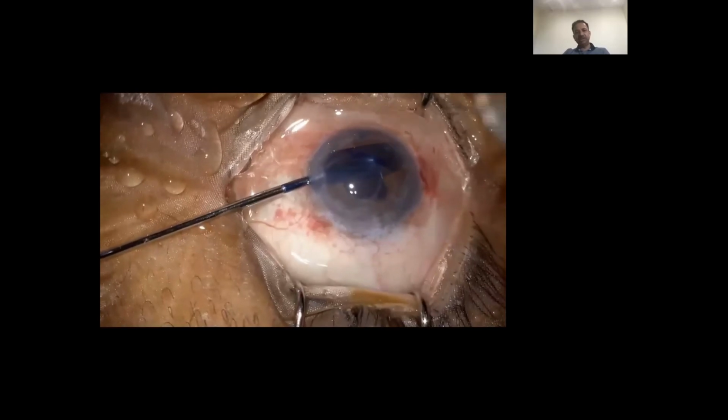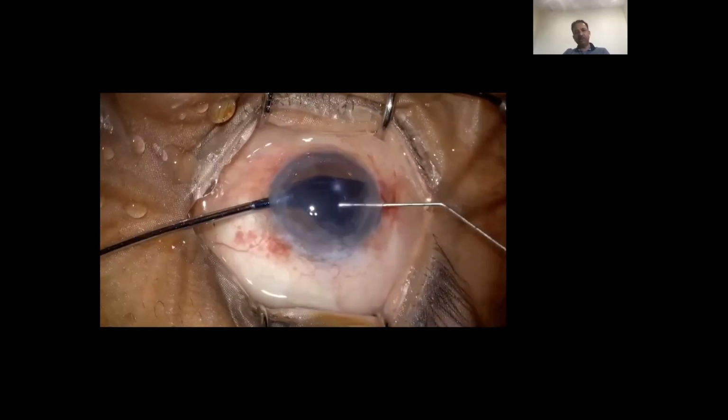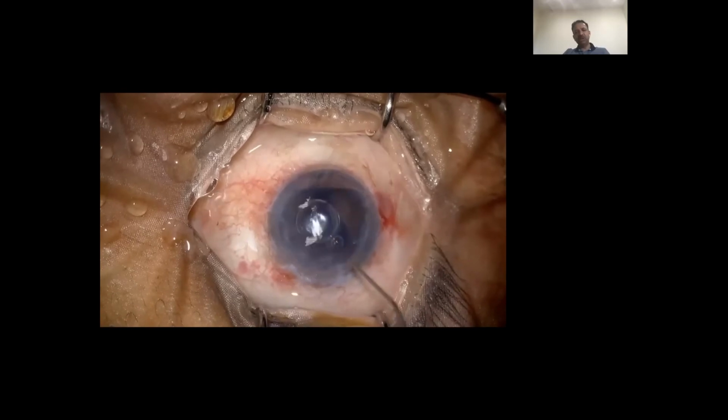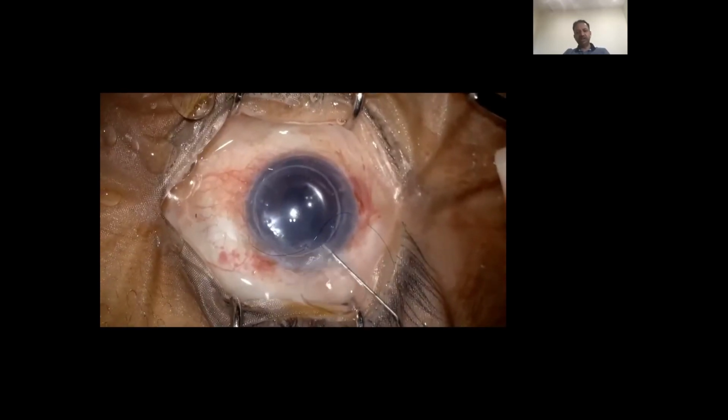The AC maintainer is running very slow. You keep holding the graft, tap it, let it open up, and then place an air bubble within the scroll. Remember, it's endo-in, and then you move the air bubble to unfold the graft. And once it's in the desired position, you enlarge the air bubble.